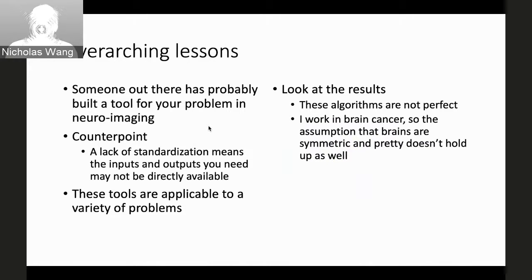And I will say there's a caveat: because everyone does things a different way and has their own particular problem, while my image data set may have standard MR sequences like T1, T2, FLAIR and contrast, other people may be looking only at T1 and T2, or they may expect diffusion-weighted imaging, which I don't have, or a proton density weighted map that I don't have.